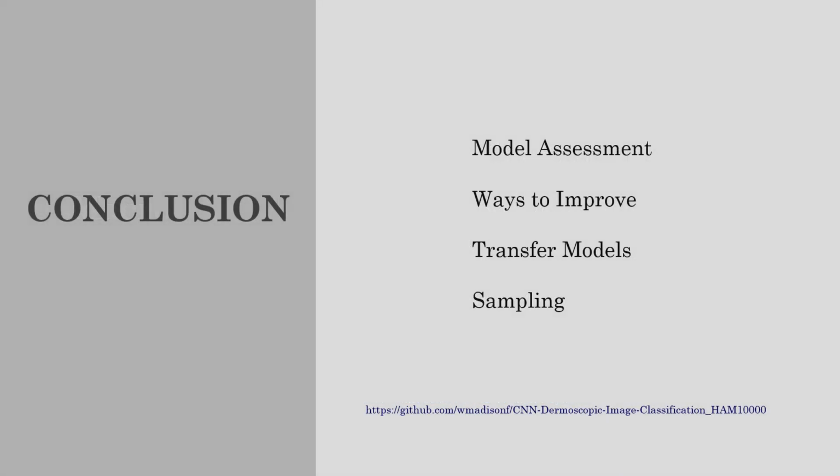Increasing the training through data augmentation did not have a significant effect on overall accuracy, but did help improve minority class scores. It is likely that the performance result could have been improved by using a larger sized image input, a much greater number of images available for training, and a larger compute capability to allow a deeper model build.